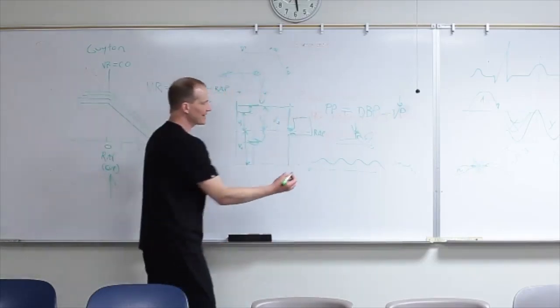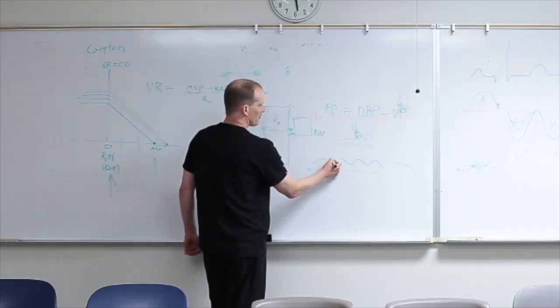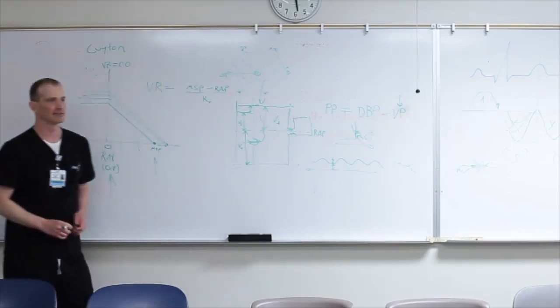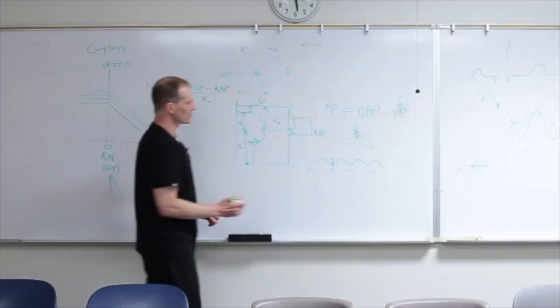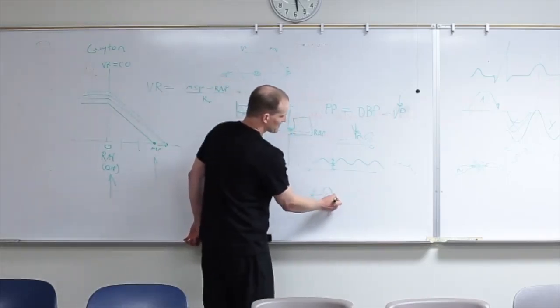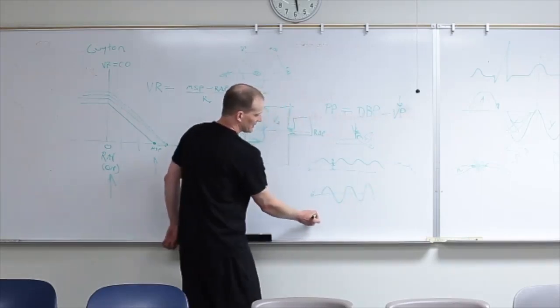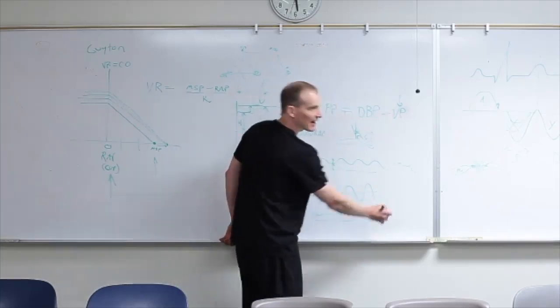And we start to see bad things happen when this amount of pulsatility gets higher than, say, 30%. And as this gets worse and worse, it actually becomes biphasic. And then ultimately, with bad portal hypertension, it goes away from the liver into the gut.